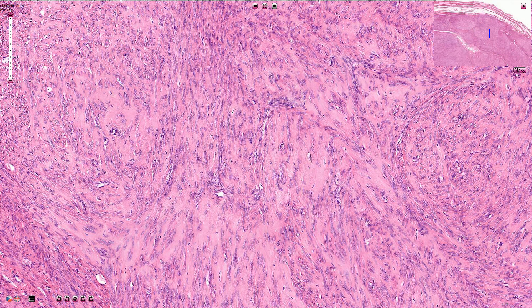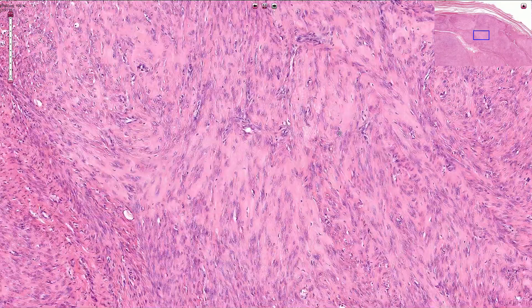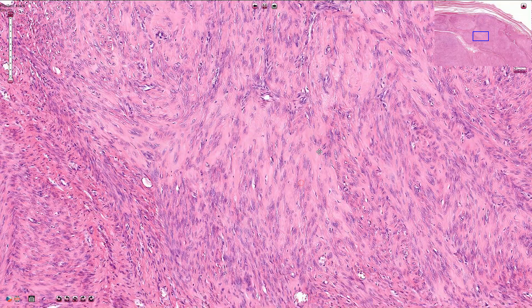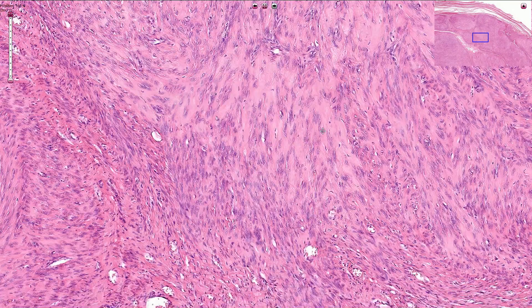In between the cells we can sometimes see collagen fibers, and a collagen component which is quite prominent in this example of leiomyoma.